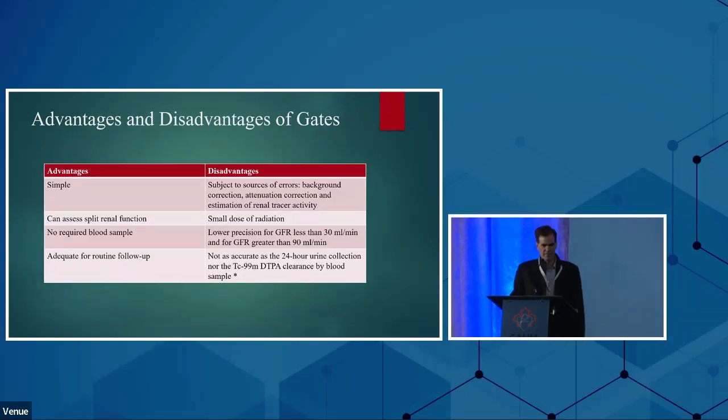So the advantage of Gates is simple. It can assess the split renal function. There's no blood sample required. And it's adequate for routine follow-up, according to some physicians.